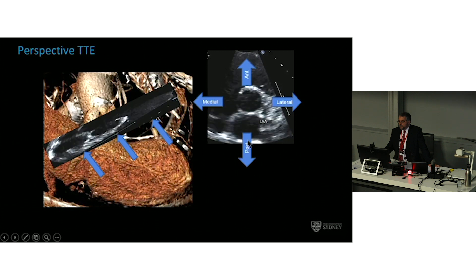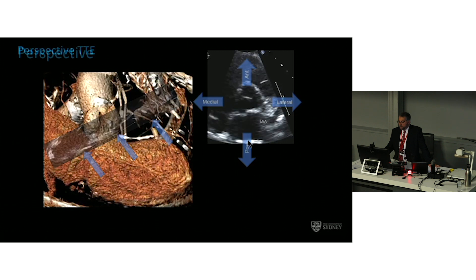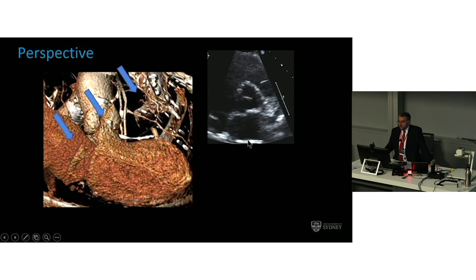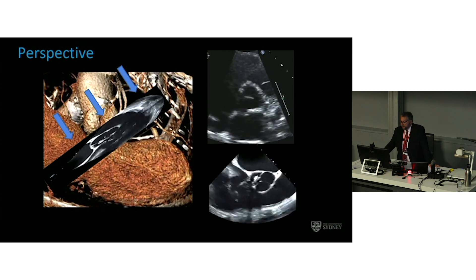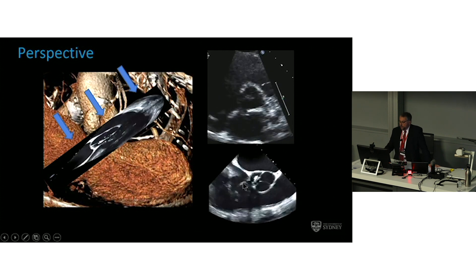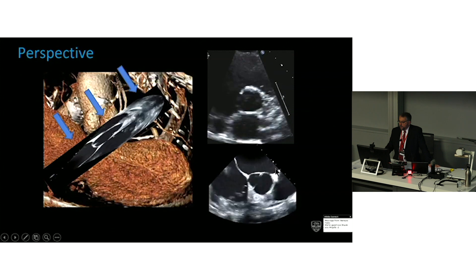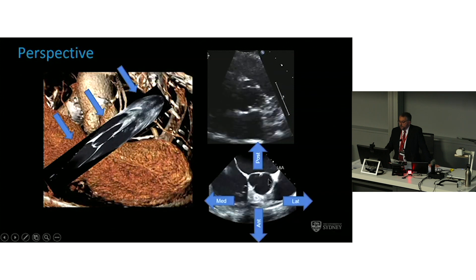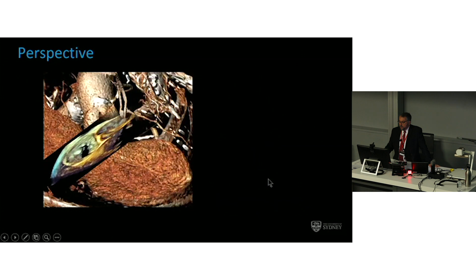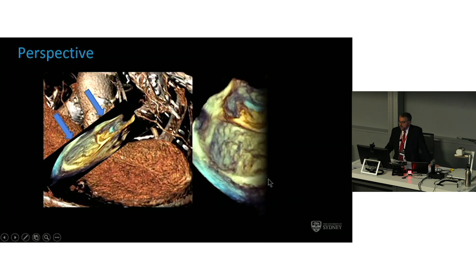Lateral, medial, anterior, posterior. Now in transesophageal echo, we tend to look from above, and the same rules count. There is the atrial septum, therefore non-coronary cusp. The most anterior is therefore the right coronary cusp. The left atrial appendage is just here, so therefore that's the left coronary cusp.